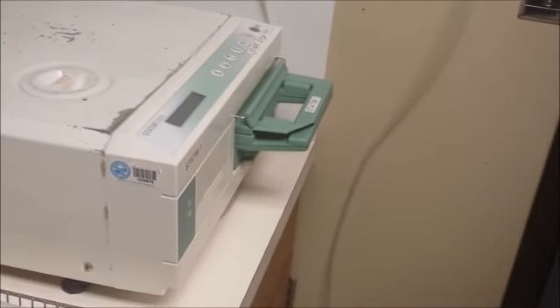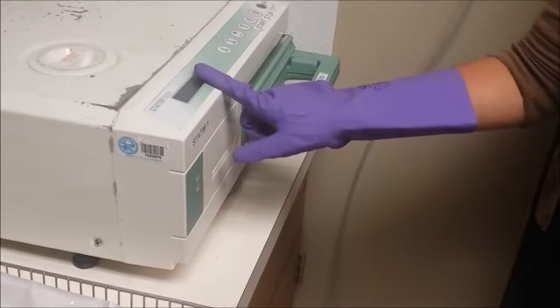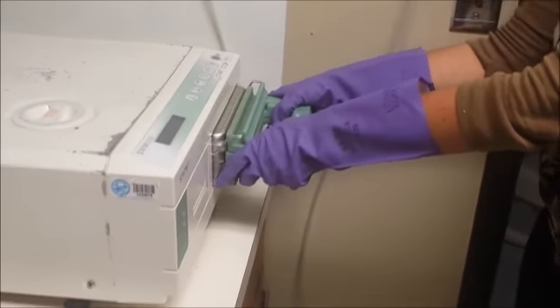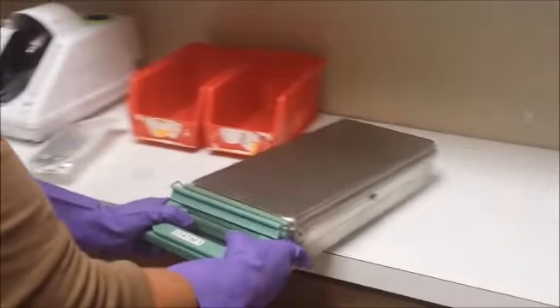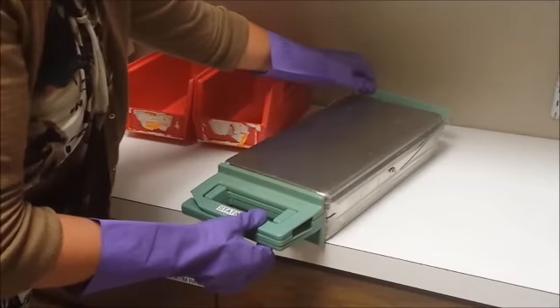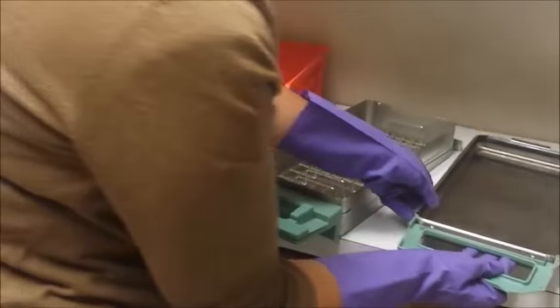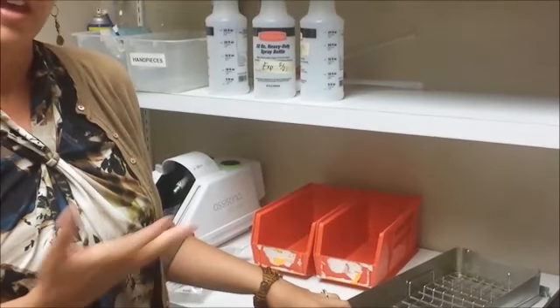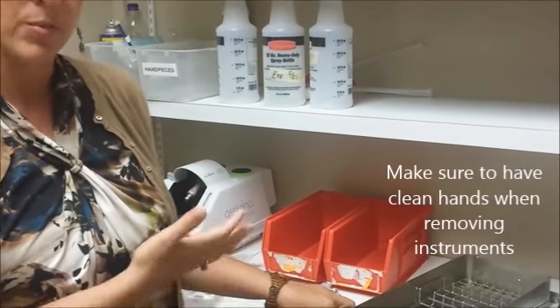When the cycle is complete, the LCD display will read 'cycle complete, remove cassette.' Simply remove the cassette and keep it on the sterile side of the countertop. To open it, push that arm back and lift up on these little bars. You can then take your instruments out. Once instruments have run through the Statim autoclave they are clean, so you don't need to wear utility gloves at this point — and you definitely don't want to touch the sterile instruments with dirty utility gloves.